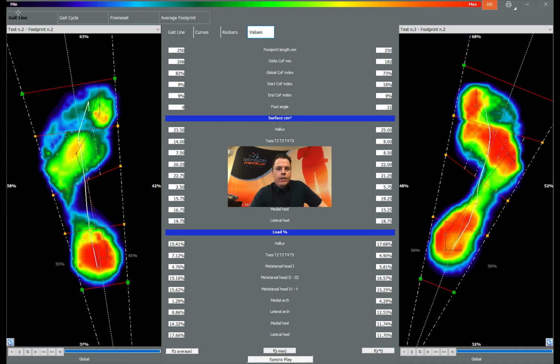So here's why I wanted to share this. This particular individual spends about 12 hours a day on her feet. And one of the things that we do before we do these stem cell injections now is everybody that we see gets a gait analysis, and here is why. This is her gait analysis.